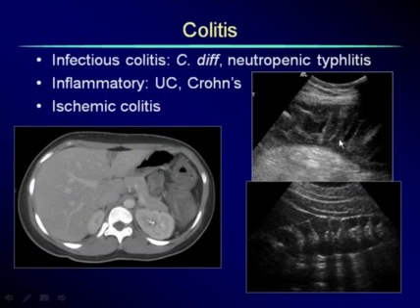Here's a patient that had left-sided pain. And in the left side of the abdomen, as we were looking at her kidney, after we examined her pelvis, we found something that looked like very thickened haustral markings, thickened wall, non-peristaltic. Here's another case, similar kind of appearance, of very thickened bowel wall. The CT shows us that this is indeed the colon, with a very abnormally thickened edematous wall.